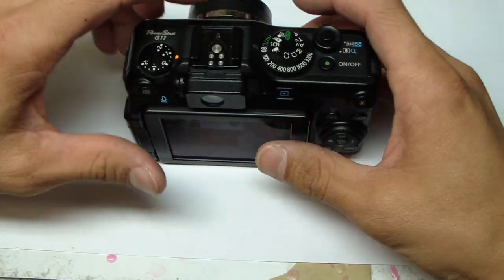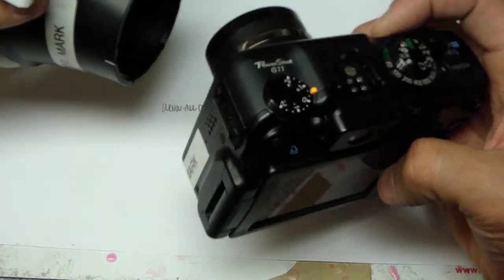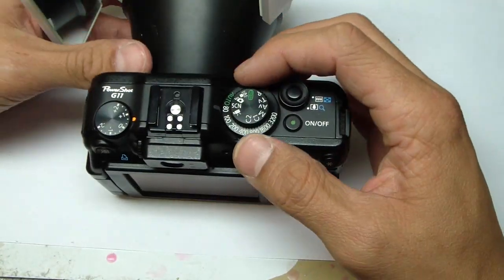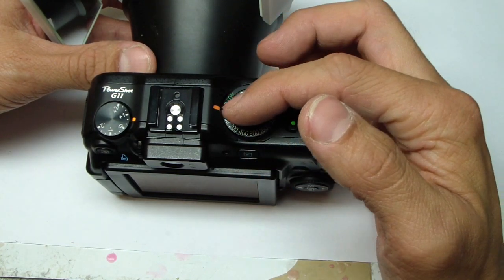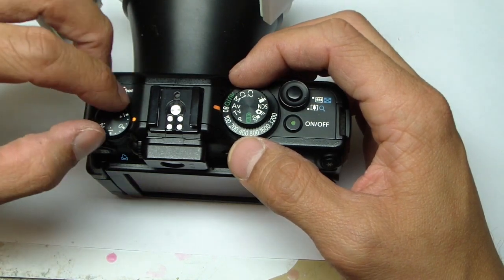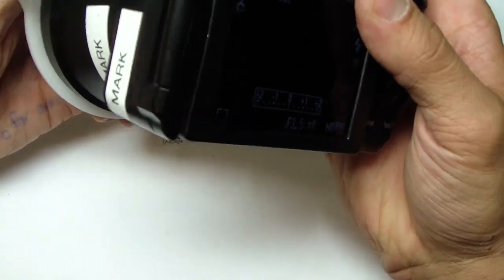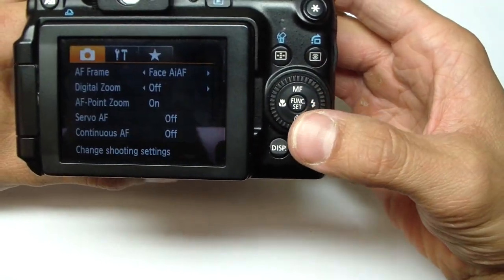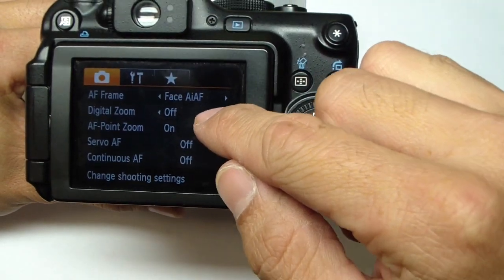So for intraoral, I'll show you right now with the macro lens. The PhotoMed gentleman taught me on the phone real quick about some of the neat settings. So initially, when you get the camera, we'll set it to AV, set the ISO to 80. You can set this as 0. And some of the things that I have set, we'll go into menu, and just some of the settings I have here. Let's see if I can get this. There's no face.